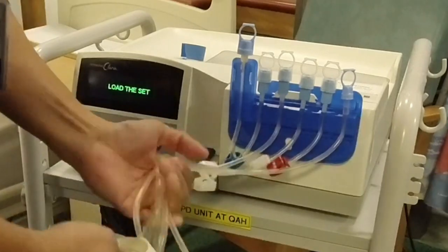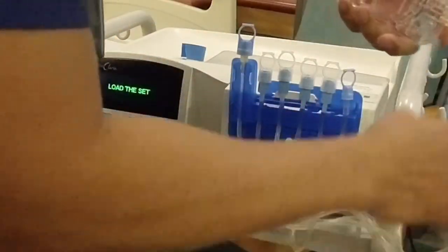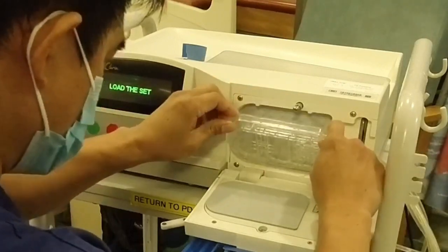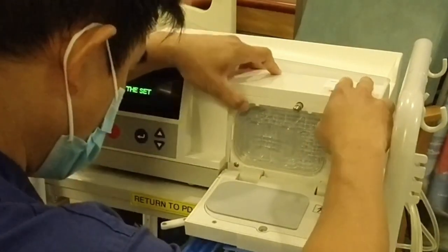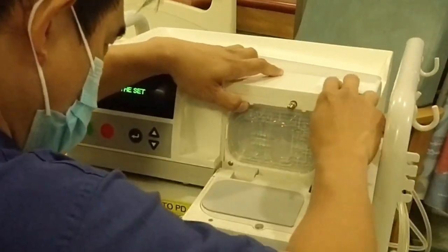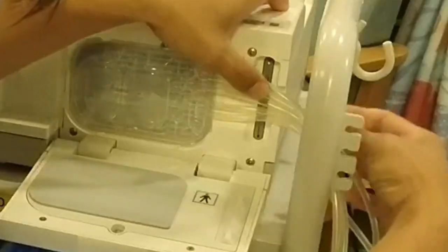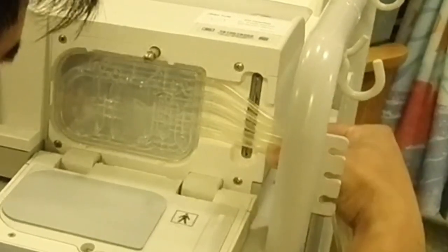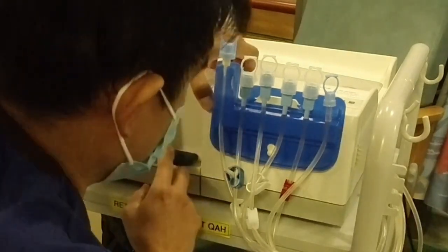Then you want it to be free of kinks. Try not to kink these lines, because sometimes this is the problem. So you put that one first. Open the chamber. There are four corner sensors here. If it is properly pressed in place, you shouldn't get any alarms. Make sure this line is free of kink, because sometimes it gets kinked like that. And you can close it. Nice and easy.